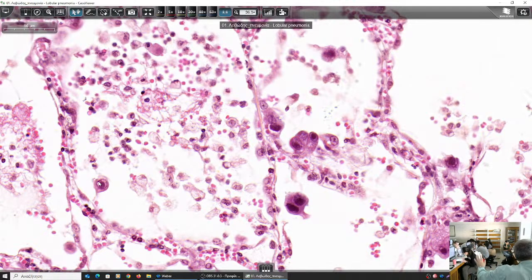So, in any case, since we have an additional infectious factor, what does this tell us about the immunocompetency, about the immune system of the patient? What do you think, Edmund? Compromised. It's compromised. So he might have HIV infection, he might have had a transplant, so I give the immunosuppression so that he does not reject the transplant. So a patient has become immunocompromised, as Edmund says. So we have an additional infection. These infections are called opportunistic infections, yes. All right?